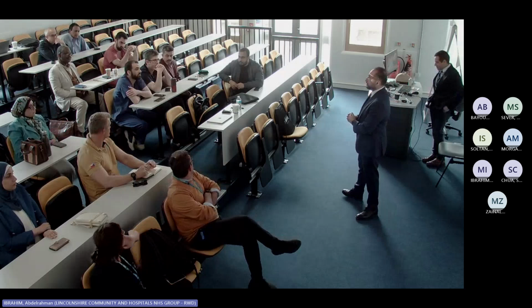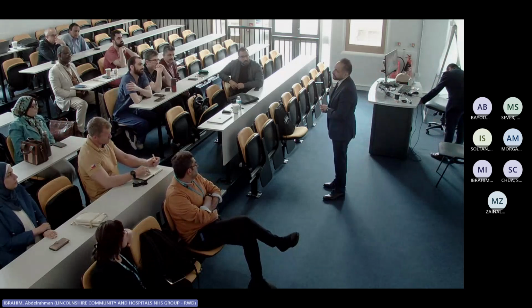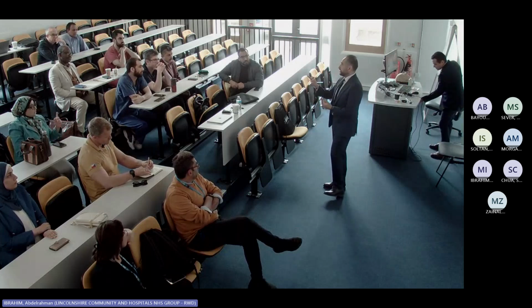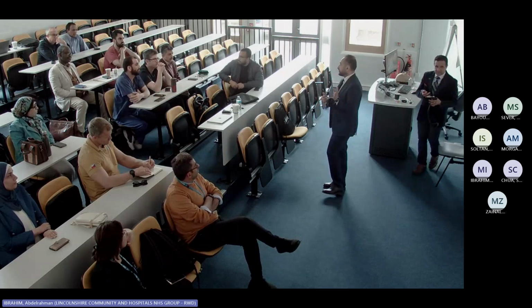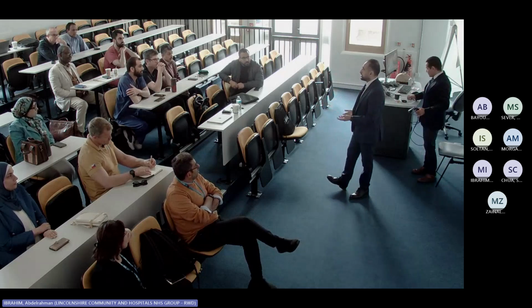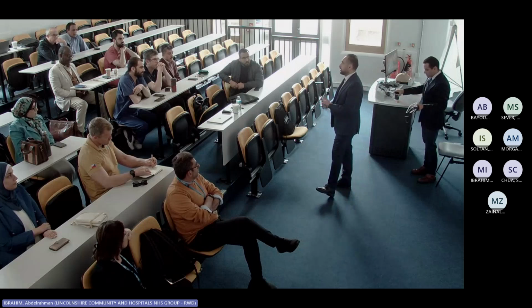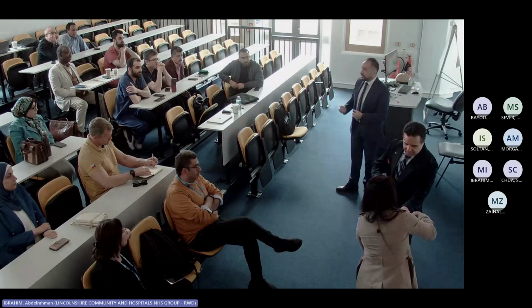Is it mandatory to do a CT scan before dilatation or not? No, usually it's not a routine thing. It will be an extra investigation that's not going to add anything. You know, the images that you have shown about CT scan, you're lucky to have this type of scans. If you order a CT scan temporal bone, you can't really assess the Eustachian tube as a whole. So it's not going to make a huge difference in your management as well.